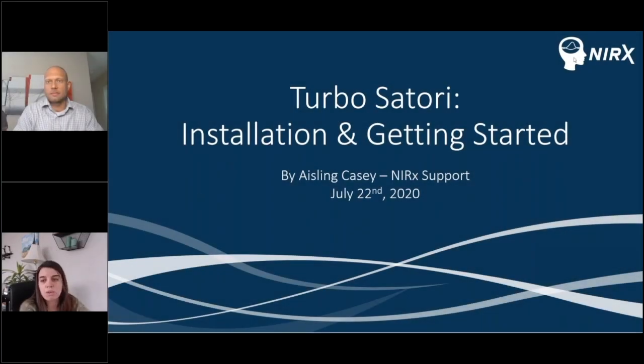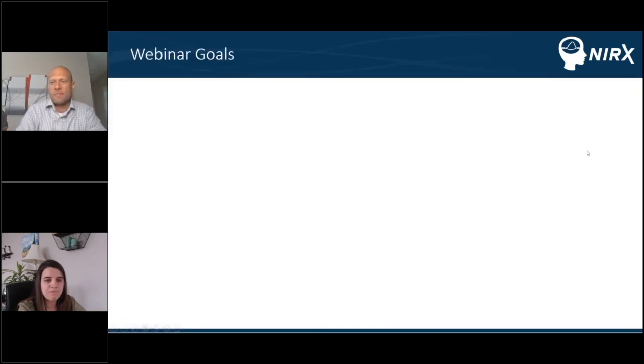Happy to be here with you and sharing this awesome real-time fNIRS analysis software, which will help users get to those really cool applications that we just saw some of, and more. So Satori really is a stepping stone to some very advanced techniques. So I hope you'll enjoy this presentation.